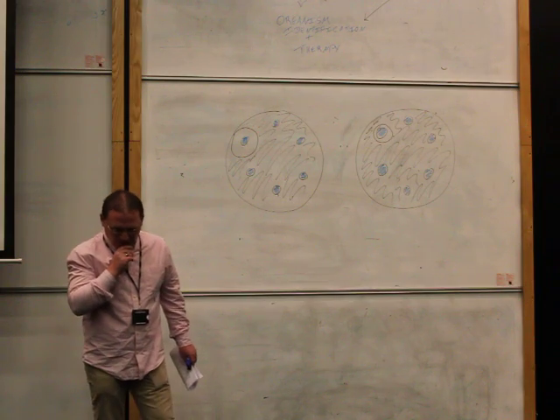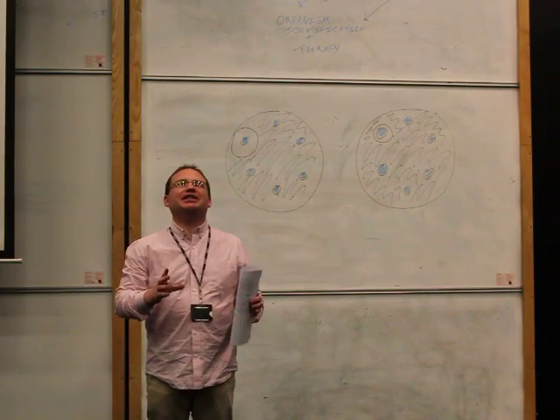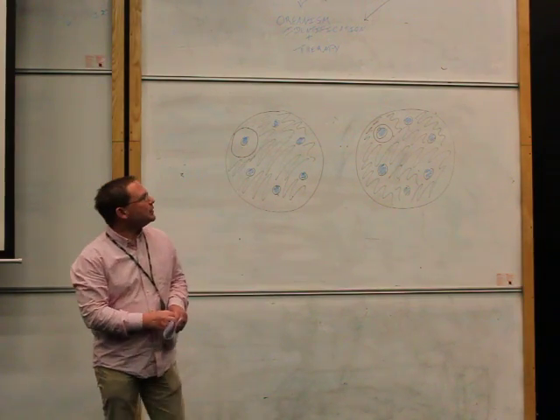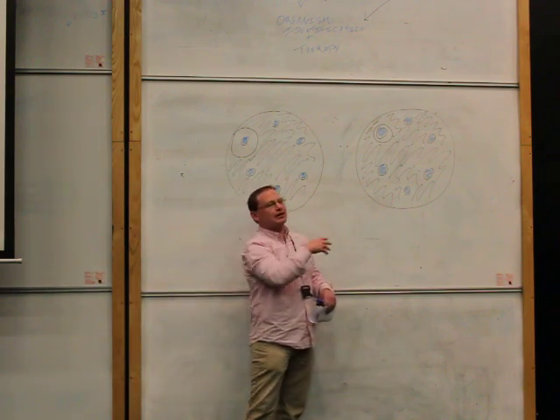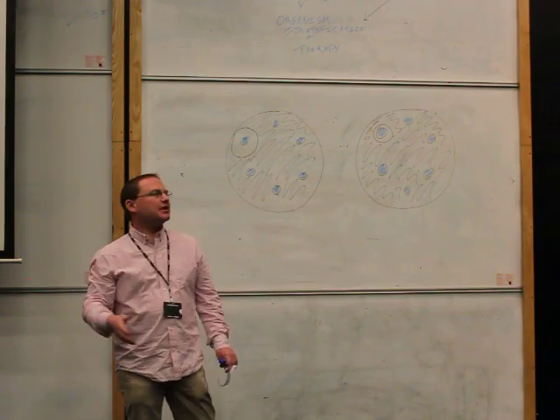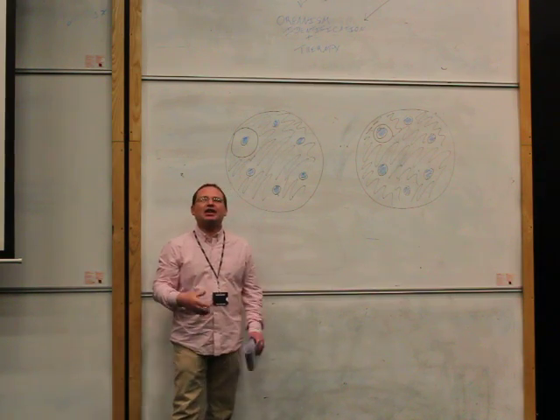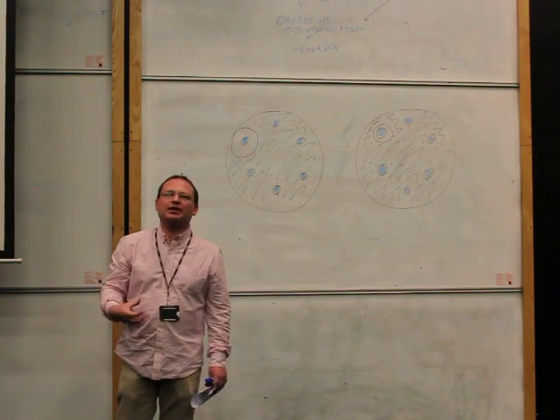So what you will be presented with in the laboratory are pictures of antibiotic disc diffusion tests. And basically what these are is we've seeded plates with the organism that we want to test. So we've covered the plate with the organism, and then we've put on different antibiotic discs, antibiotics that we would routinely test for within the laboratory.